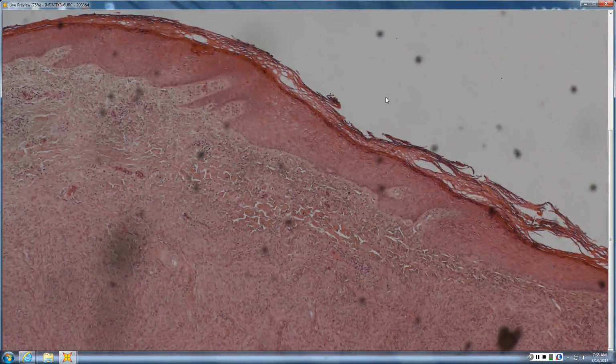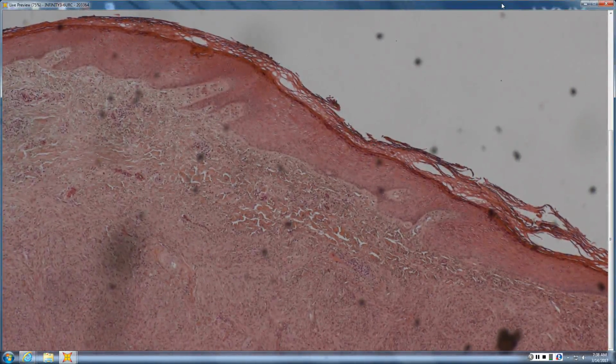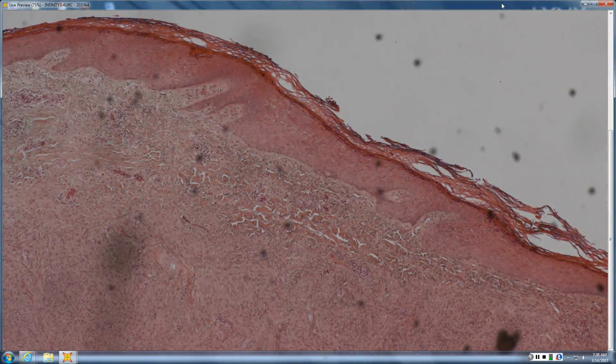Dermatofibroma. So your first question is, is this some kind of DF? Because it's a big honking fibrous tumor, and yet it has acanthosis instead of effacement.